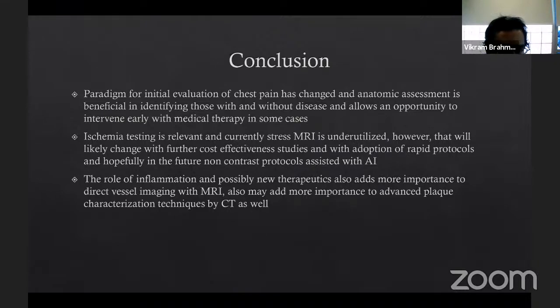What's more important is that with SPINS, we can see that within the US healthcare system, stress MRI is cost effective. And if we have clinicians who are really involved with the acquisition of images as well, there's a wealth of rapid protocols. I honestly think you can get viability, stress, function, and even a look at the valves in about 30 minutes or so. So compared to other stress modalities, it's a marked improvement.